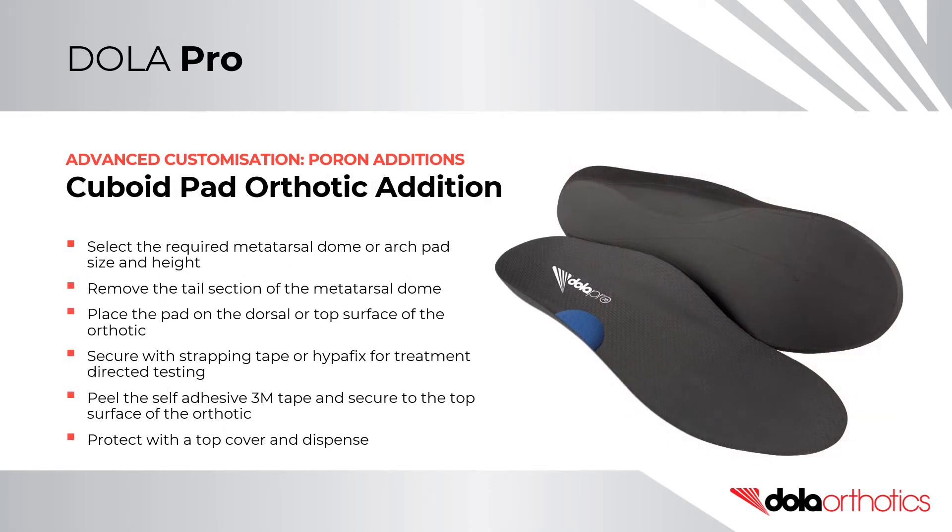Cuboid Pad Orthotic Addition. Select the required metatarsal dome or arch pad size and height. Remove the tail section of the metatarsal dome and place the cuboid pad on the dorsal surface of the orthotic. Secure with strapping tape or Hyperfix for treatment directed testing, or peel and stick with the self-adhesive 3M tape for orthotic manufacturing. Protect the cuboid pad with a top cover for long-term use and dispense.